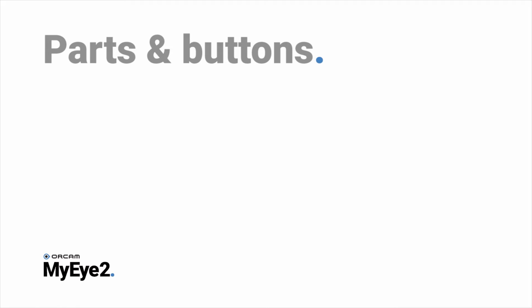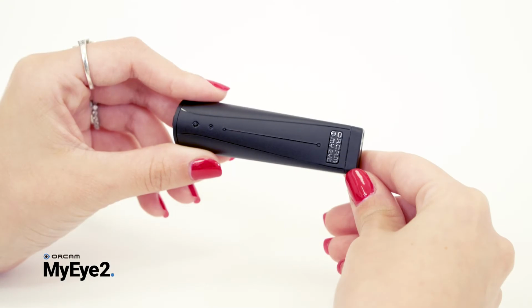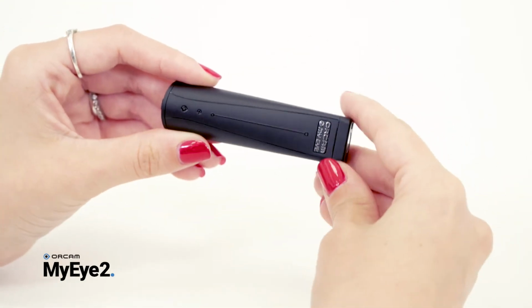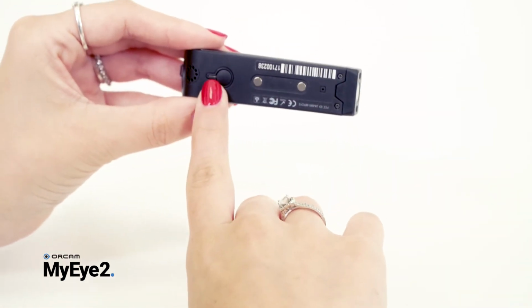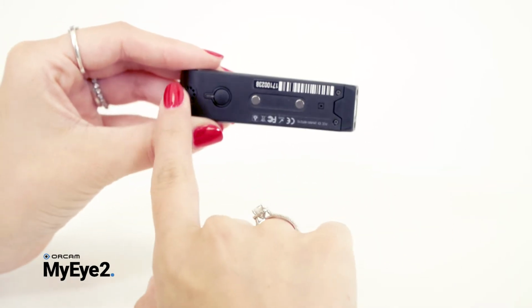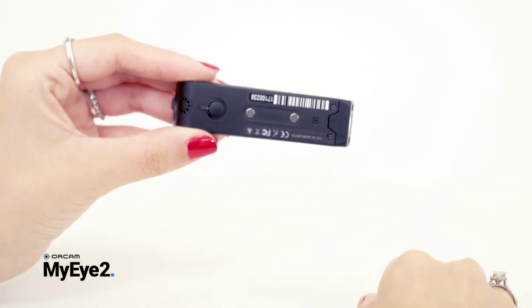The OrCam device contains all components, including its processor and battery, in one unit. The device has 2 long sides and 2 narrow sides. The power on-off button is located on the inside of the long side, which also has 2 magnets. You can move your finger along this side to feel them.